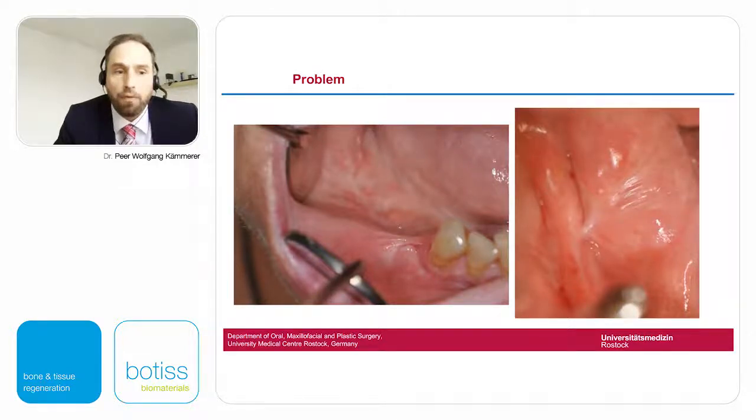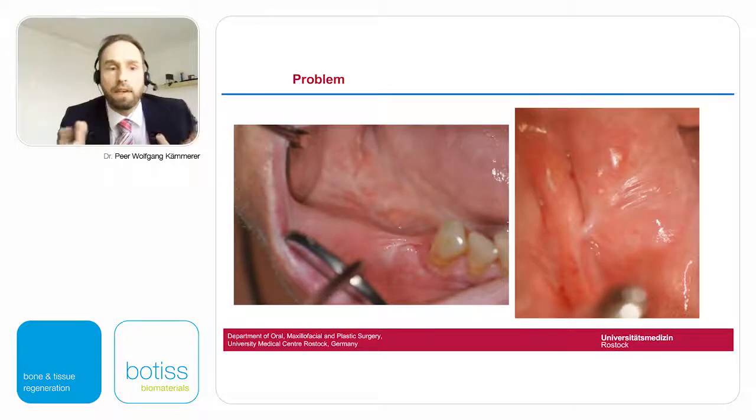A way of increasing the stability of the prosthesis in these circumstances is to deepen the vestibule by lowering the connection of the mucosa and muscle. We call it vestibuloplasty. And in general, this surgical procedure is primarily used to optimize the jaws for prosthesis integration.